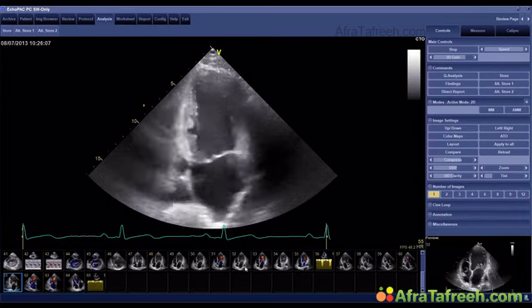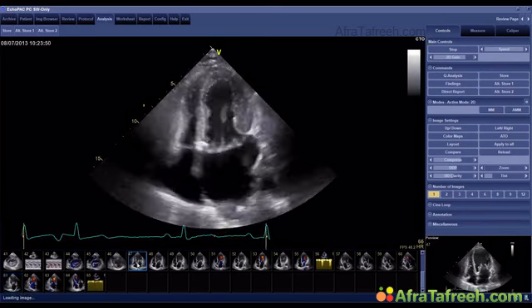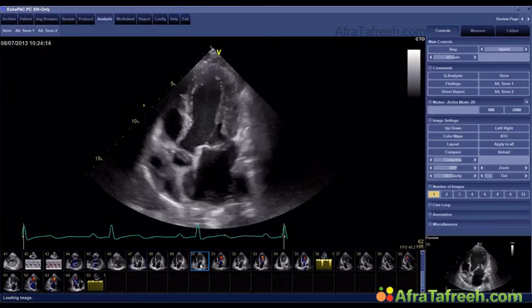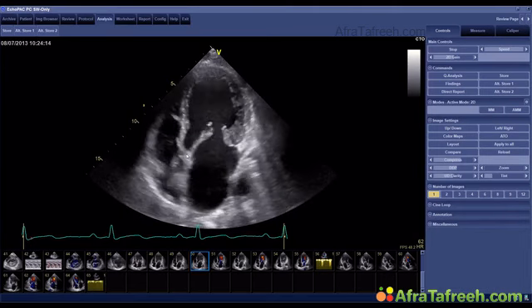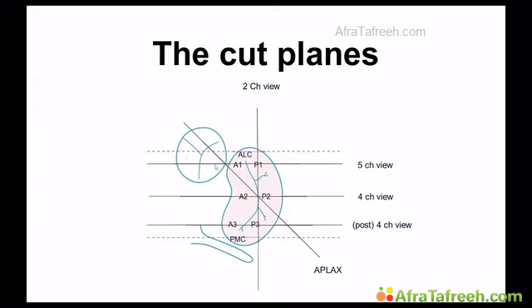is. And then finally, there's a third way of doing it, and that is by simply using a four-chamber view. You start out with a four-chamber view, and what you do is you first start out actually with a view where you have part of the aortic valve within the image. If you have the aortic valve within the image, you are cutting right here. This is the aortic valve, and you're cutting right here through A1, P1. So this is the part of the mitral valve you're seeing. So it's kind of a five-chamber view.